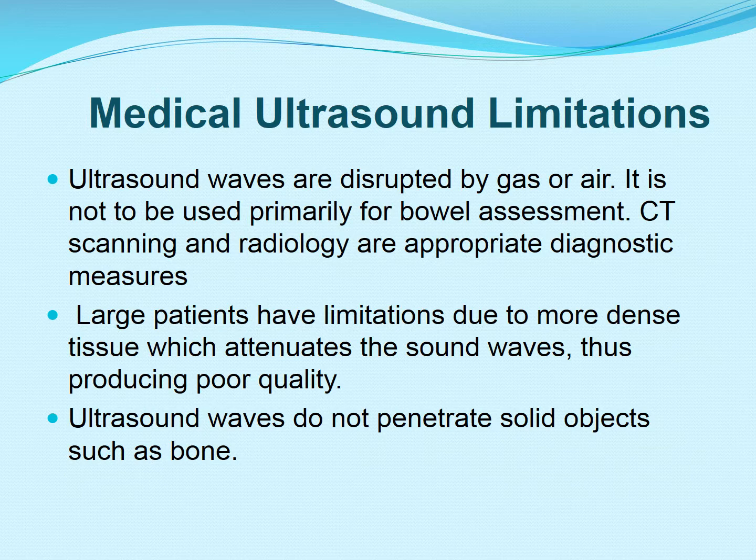However, ultrasound waves do not penetrate solid objects such as bone. So if a patient comes in with a fracture, you'd want to get an X-ray. That is the gold standard. However, ultrasound frequency heightens in a higher fluid medium, which is why when a female comes in for a GYN visit, they're told to increase their fluid intake prior to the ultrasound, which then heightens the resolution. Fetal ultrasounds require a full patient bladder for appropriate evaluation.